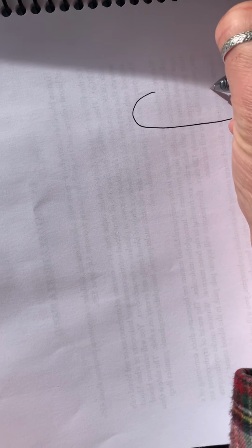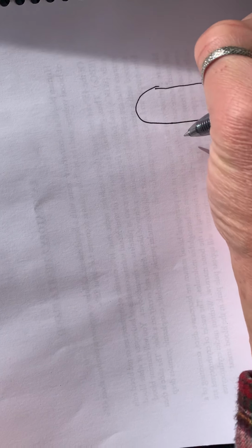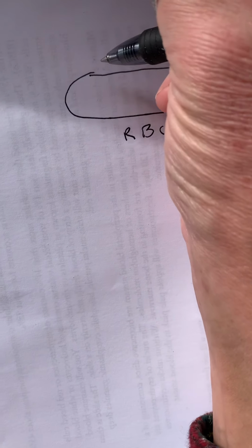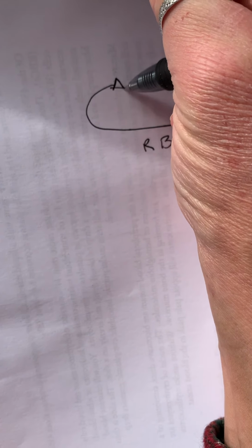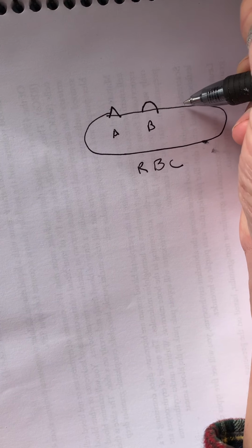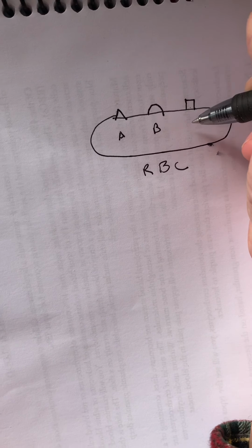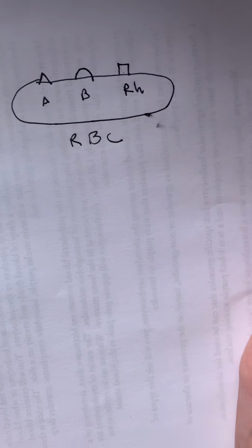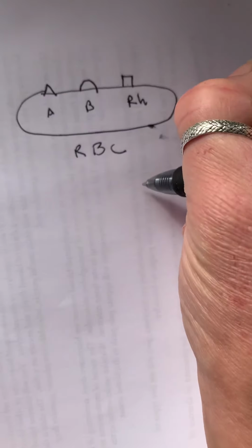All right, this is an overview of the blood typing activity. Basically, when we have a red blood cell or an erythrocyte, there are several different antigens it can have. So it can have an A antigen, it could have a B antigen, or it could have an RH antigen. And these are determined by genetics as far as which antigens we have.